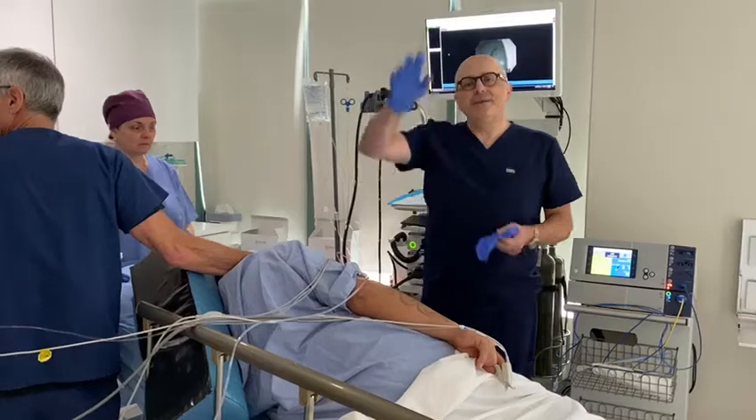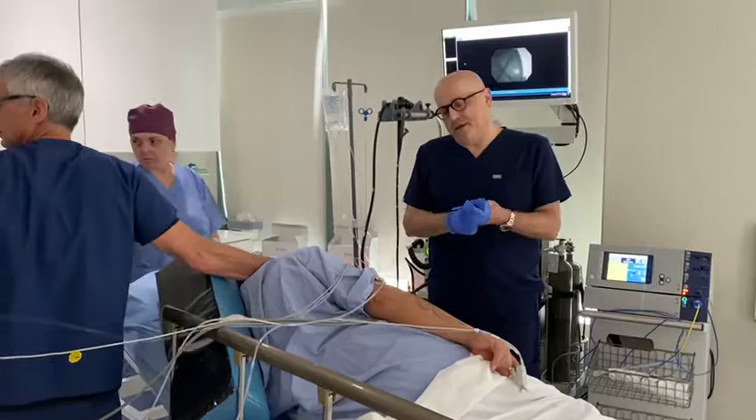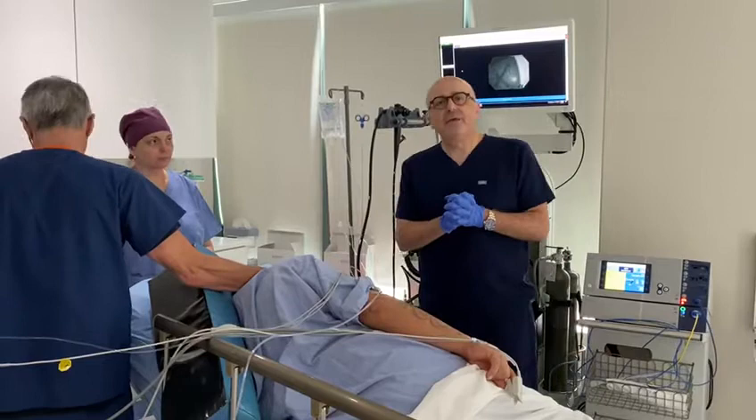Hi everybody, Dr. Batash here. Today we're going to illustrate the insertion of a gastric balloon. This gentleman has a BMI of 35 and he's otherwise healthy. So here we go.